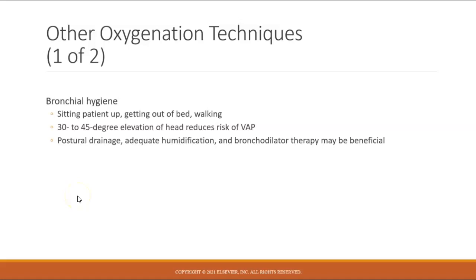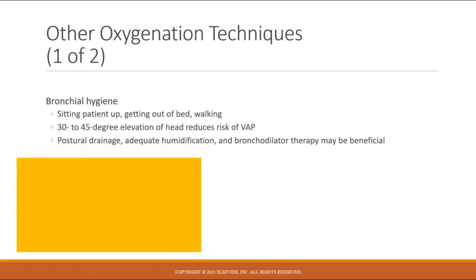I wanted to put a blank slide in here so I could explain this for you again. So just to recap with optimal PEEP and FiO2, the things that you need to know is I have an FiO2. I want to keep it below 60%. I don't want to be above 60% for more than 24 to 48 hours. So I want to try to minimize my FiO2 to being below 60%.